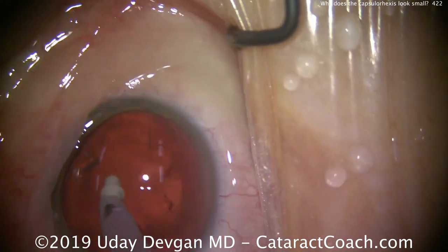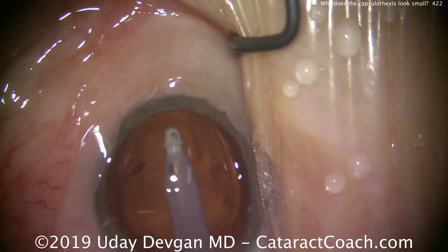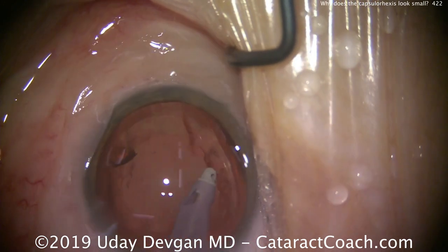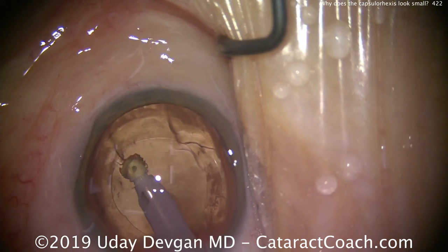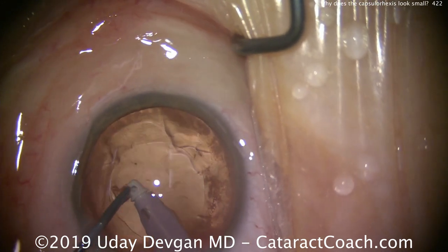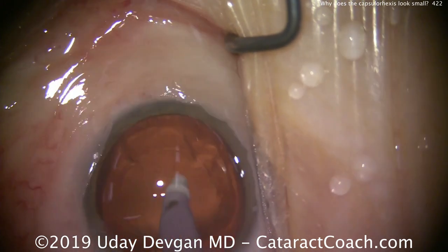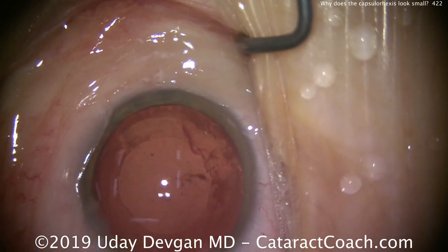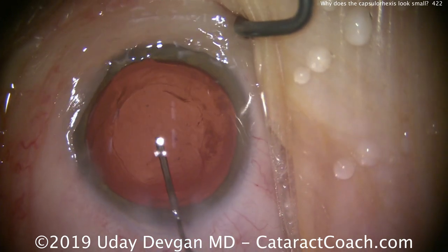For lens calculations, do not let these patients end up hyperopic. Never aim for a plano outcome — even when using fancy lens calculation formulas like the Ladas super formula, the Barrett formula, or other modifications to account for ultra-high myopia. These patients don't want to be plano. When they start off so myopic — like this patient who's about minus 15 to minus 20 — if she ends up in the minus one, two, or minus three range, that'll be a huge success.